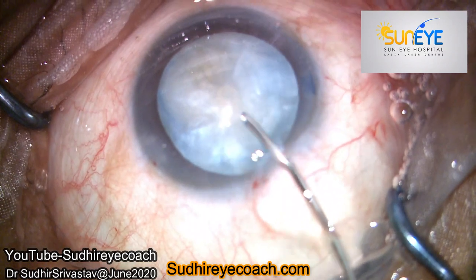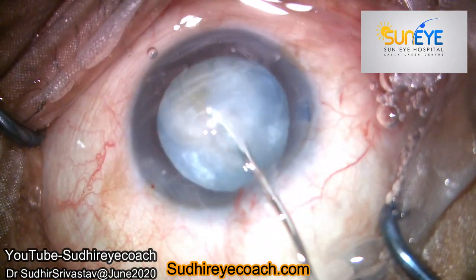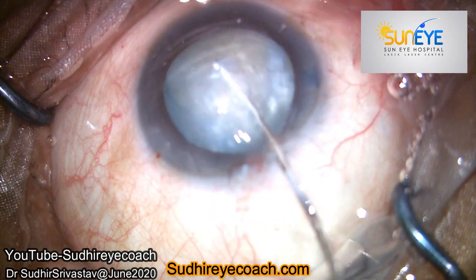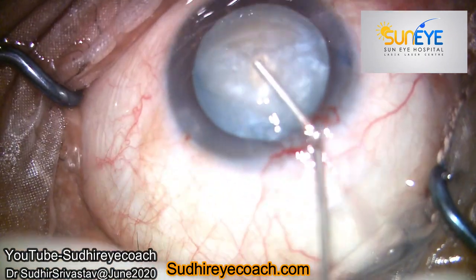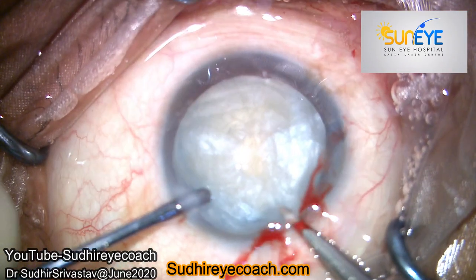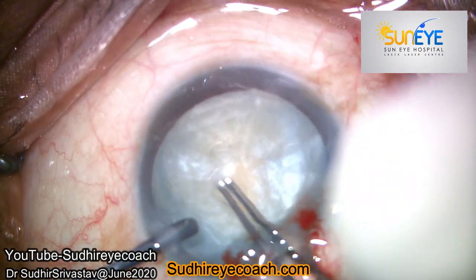It took me a few seconds and I successfully flushed out almost all the cortical matter and fluid present in the bag. The nucleus was not very big — it was small — so the fluid trapped behind the nucleus also came out easily. I then refilled the chamber with high viscosity viscoelastic again.